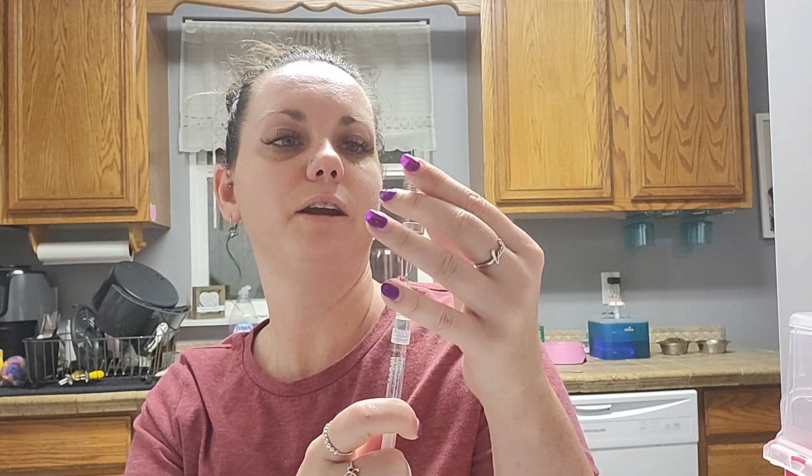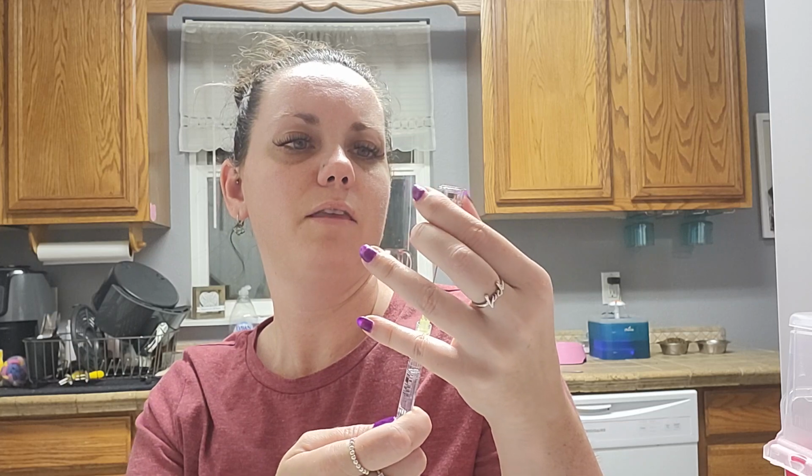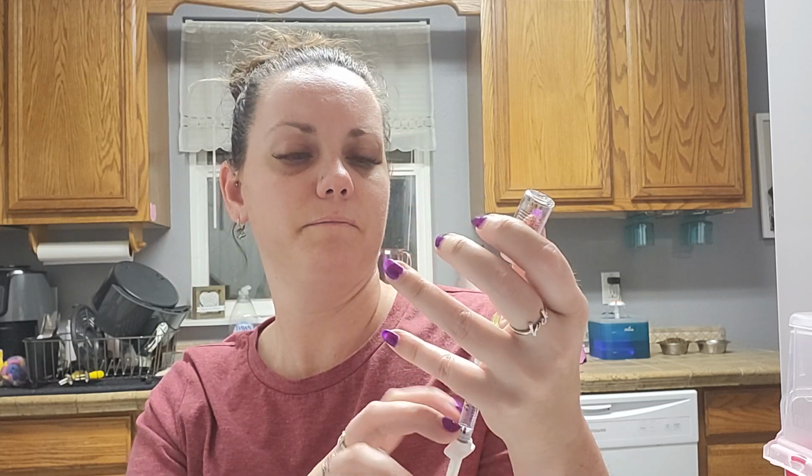And it looks like there's gonna be a little bit left over in the bottle. I think I'll inject some fluid back up into the vial and just see if I can't bring more down with it. Okay, that worked.